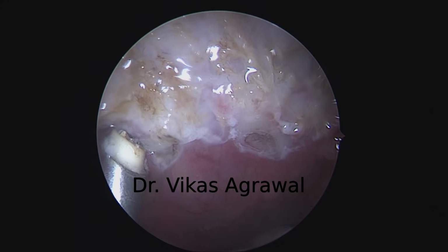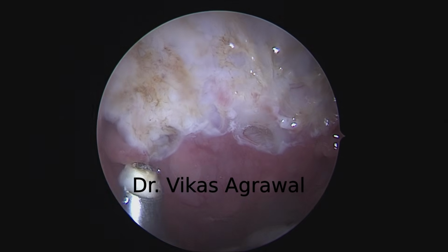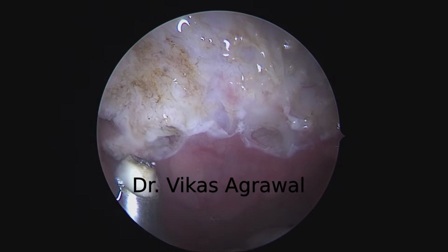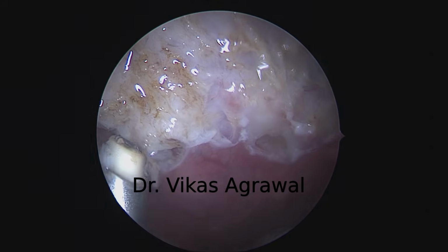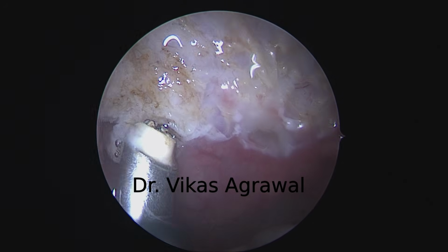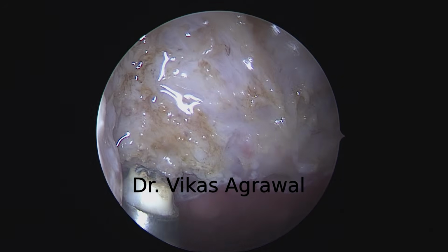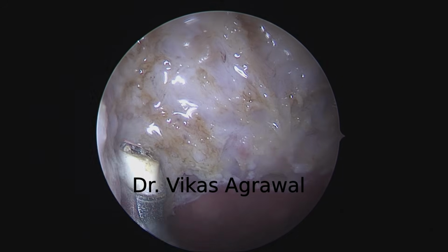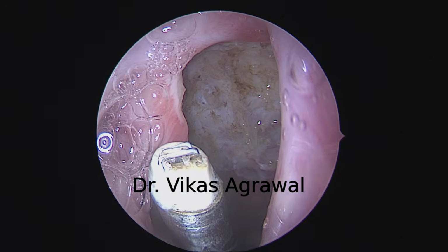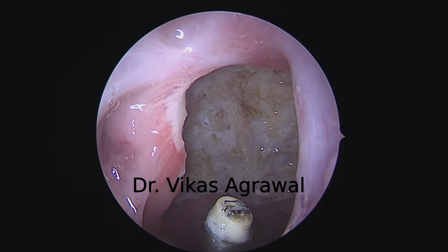All right, but you can always coagulate the last layer if you are not very sure about the hemostasis in that area. Even coagulation will work to a great extent because you will take away the live tissues. And see, the moment you go very close, you might open up the muscles, which will be painful. So it's not recommended to open up the muscles and inflict pain. Now, this part is pretty alright, so my surgery is almost complete.